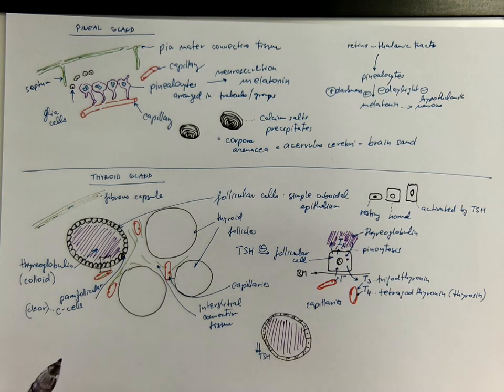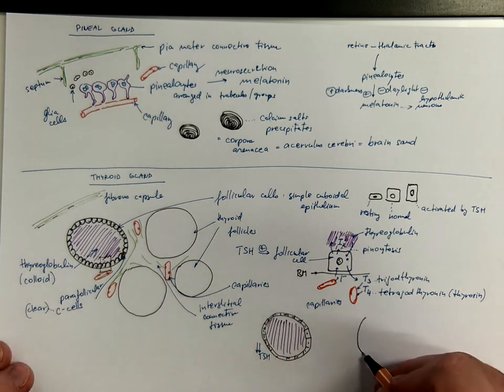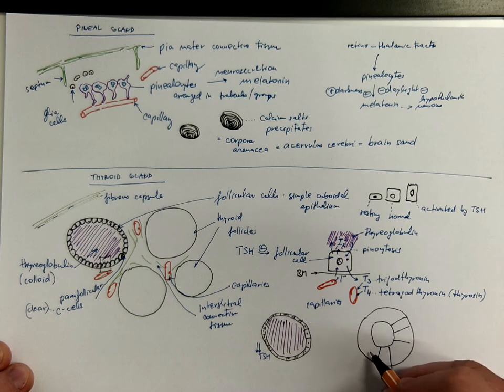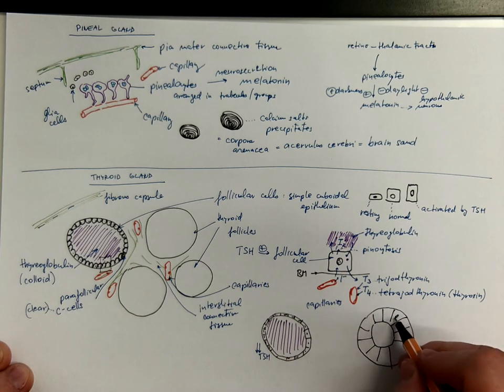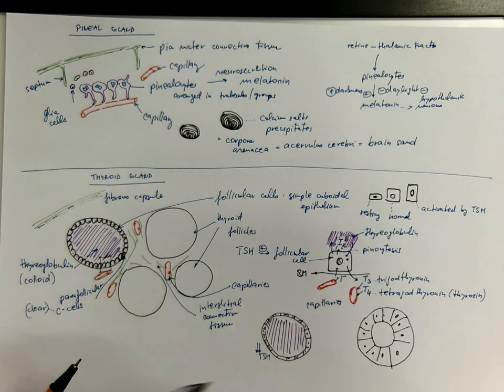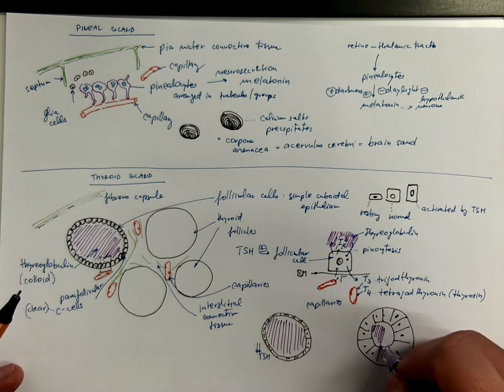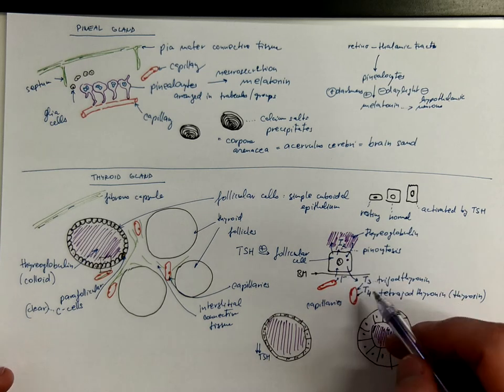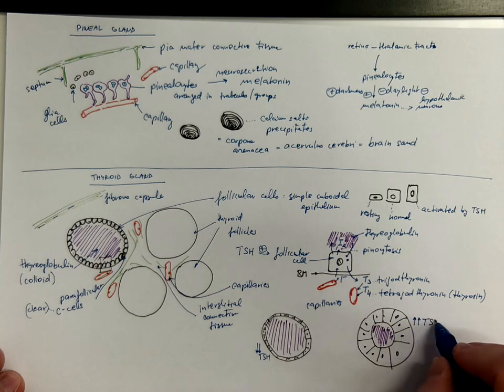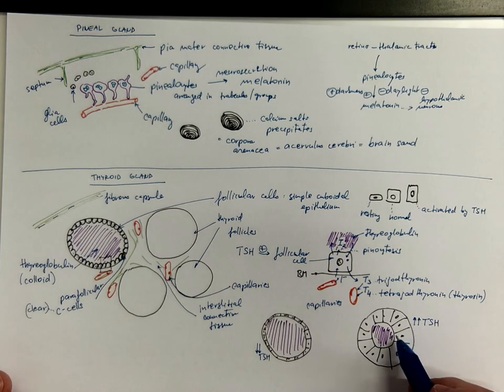However, if in the opposite, the thyroid gland is overstimulated, the epithelium is very tall, it's even columnar, there are only small amounts of thyroglobulin because the thyroglobulin is produced and instantaneously it's decomposed and released into these T3 and T4 hormones, and this is the histological picture of a significant stimulation of follicular cells by the TSH.